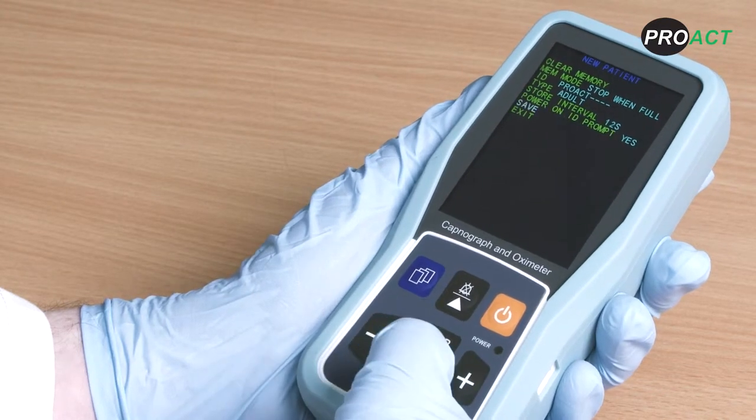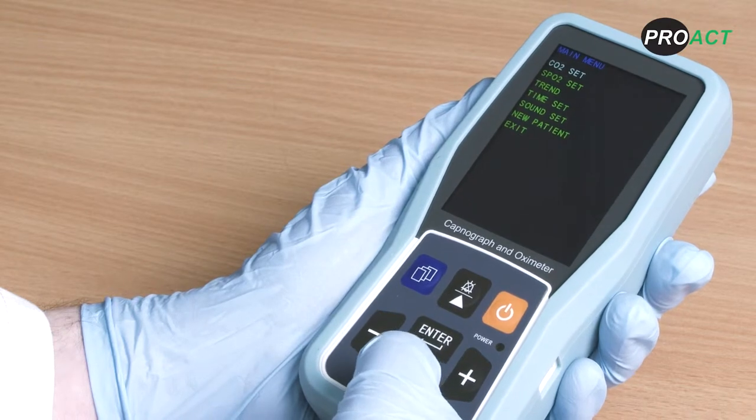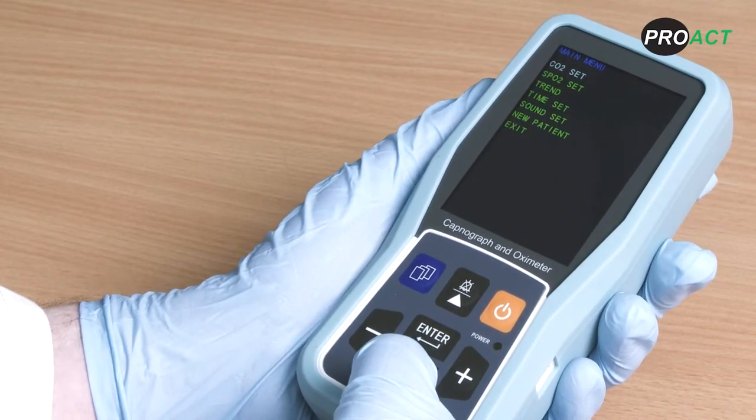To save your settings, click save. The device will ask you to confirm your choice — select the white highlighted option. These settings will now be latched to the device every time you turn it on.